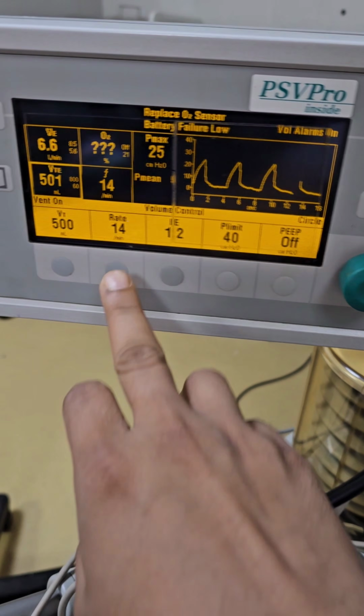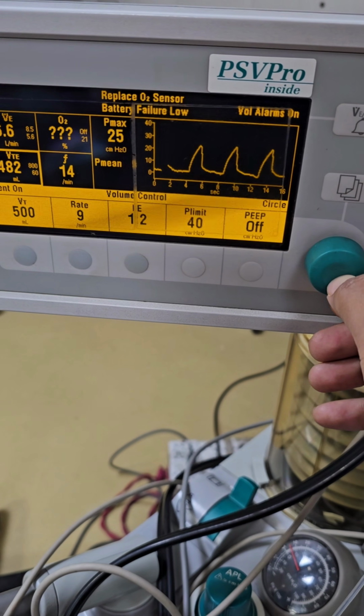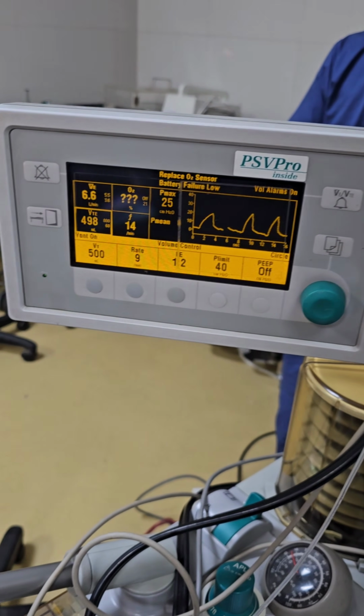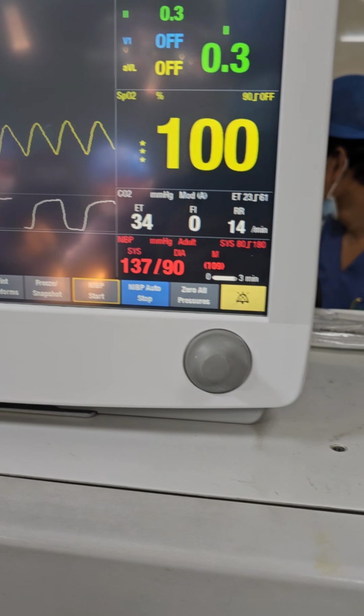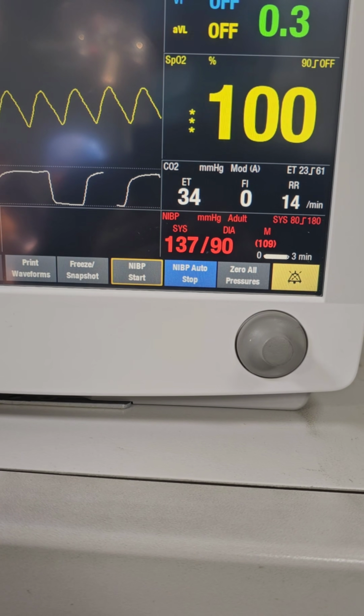And we are reducing the respiratory rate to increase the ETCO2. As we know, if the ETCO2 is reduced, the patient will not trigger breathing during reversal. Yeah, we are seeing the pressure 137 by 90, which is perfectly okay for us.